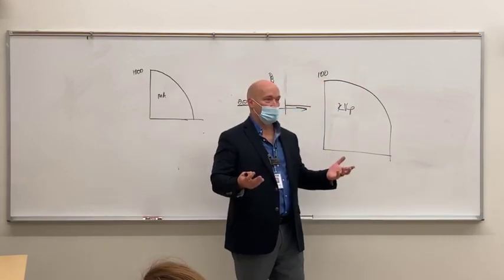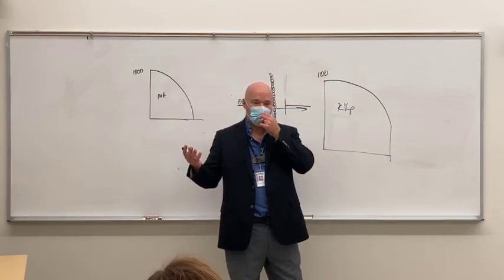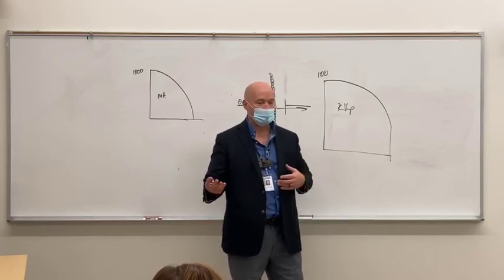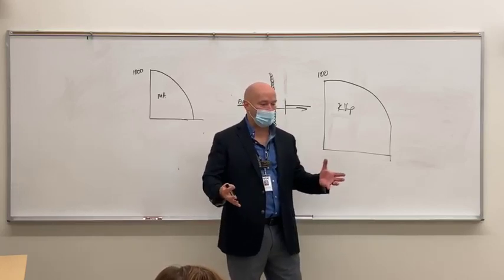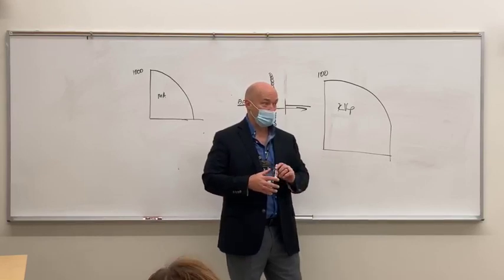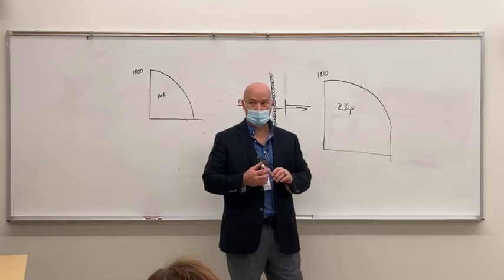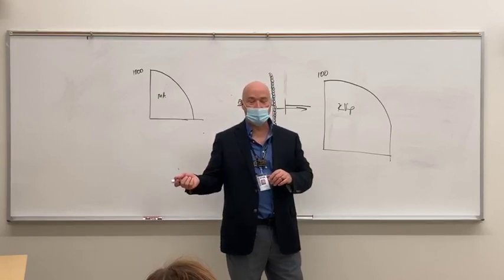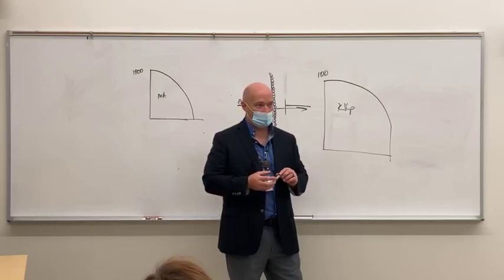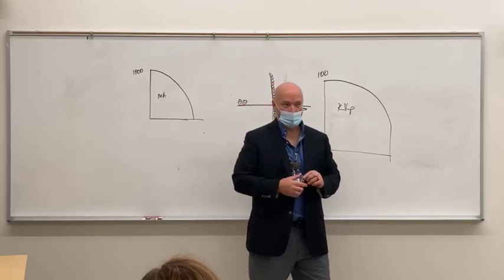It says all of the components on the control panel work off low voltage. True? Yes. And are found in the low voltage circuit. False. Right. Okay.